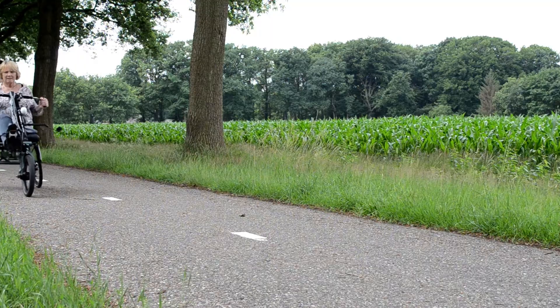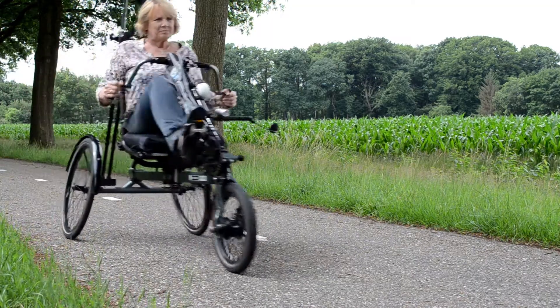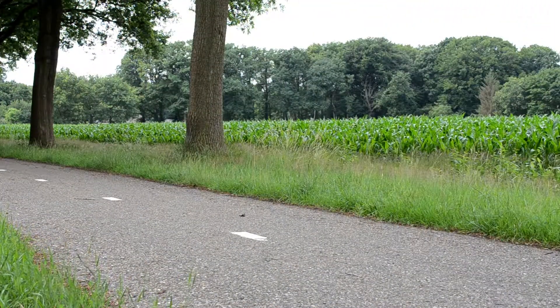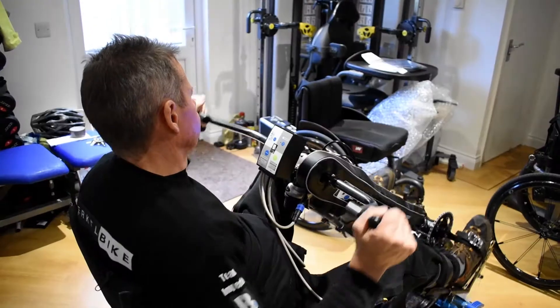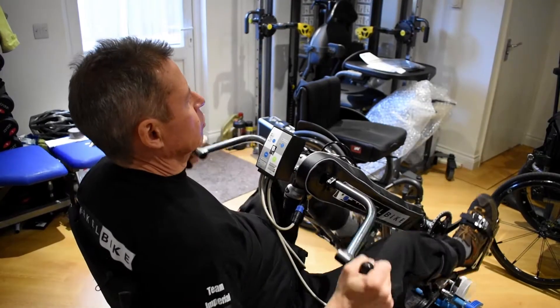The Birkle Bike Pro is a combination of a hand bike and a tricycle. This bike can be driven by the power of both your arms and your legs. The Birkle Bike Pro is especially suitable for people who have difficulty walking and cycling.